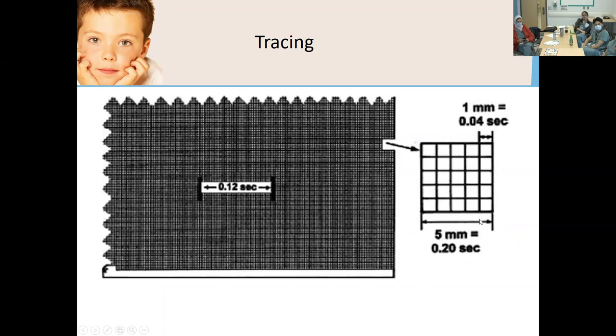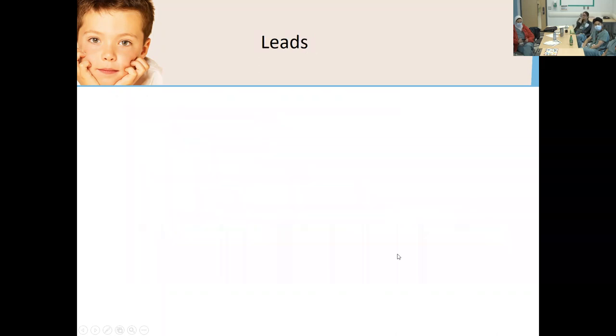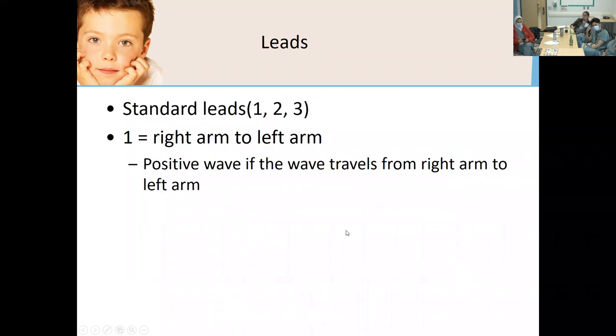To summarize the standard calibration: 0.04 seconds per small box, and five millimeters equals 0.2 seconds. You need to be aware of calibration because when voltages are very high — especially in hypertrophy or hypotrophy of a cardiac side — you may need to adjust calibration to fit all waves within the bandwidth of the paper.